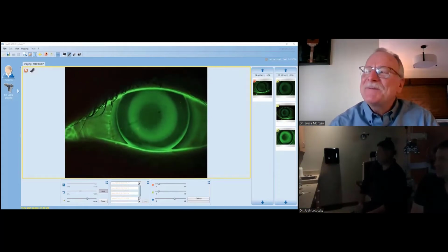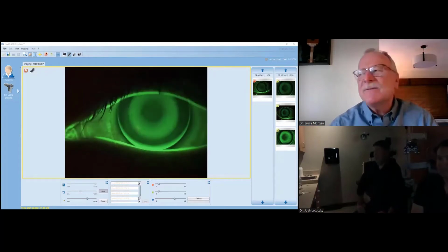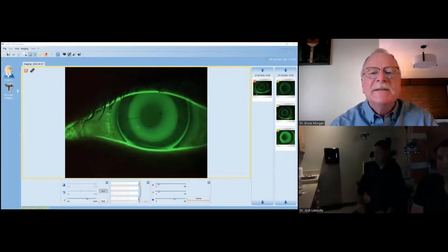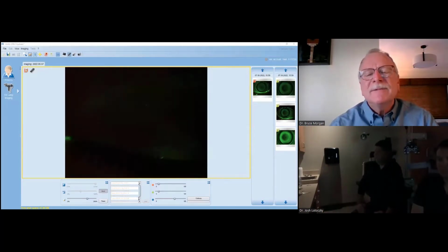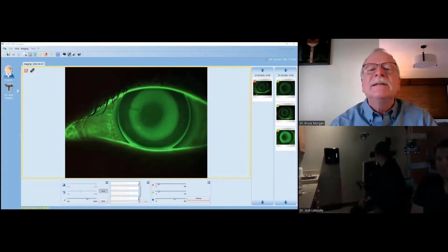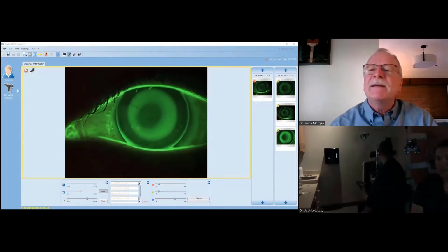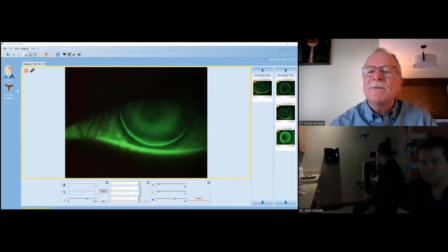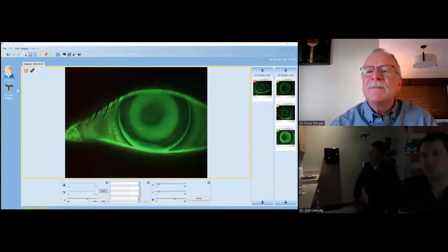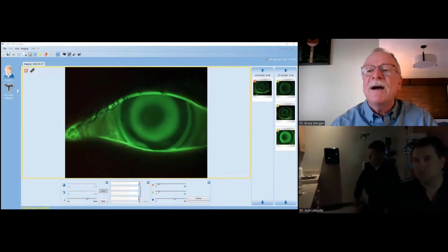And where is that cutoff for the treatment zone? Is it 2 millimeters, 3 millimeters, 4 millimeters? It somewhat depends on how much correction you're really shooting for. So that probably actually is a little bit borderline for me. It's certainly not ideal, but again, we're not in the business of making perfect pictures or perfect fluorescein patterns. We're in the business of trying to match and trying to treat that particular eyeball.